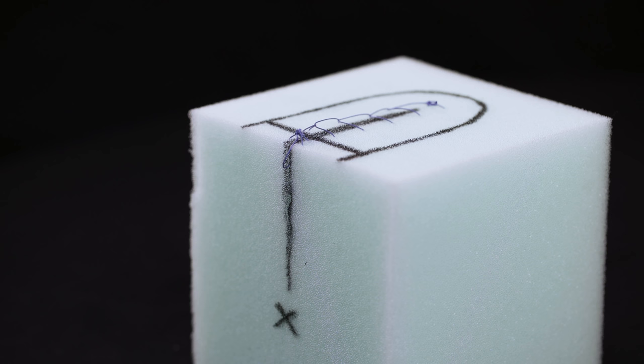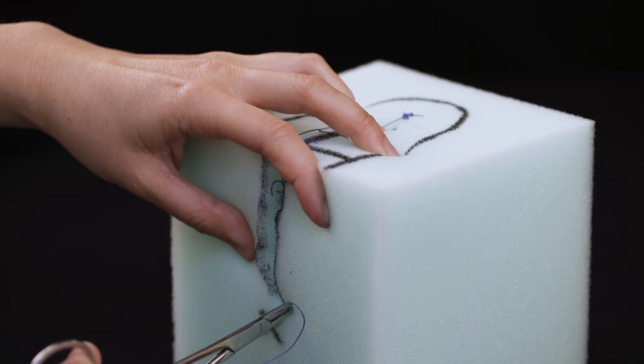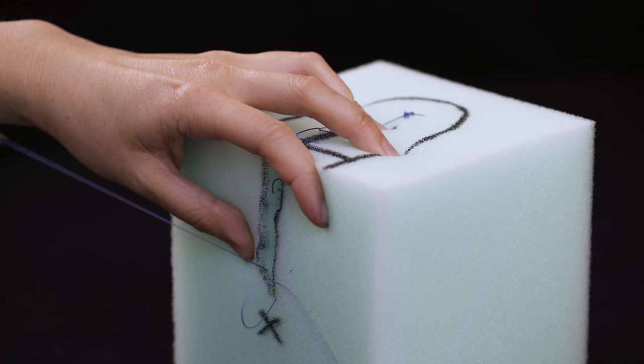The last step is closing the skin layer using a running subcuticular stitch. This is more comfortable for the patient than interrupted skin sutures. Sometimes, however, I do use interrupted skin sutures if the skin tear is short or very irregular.